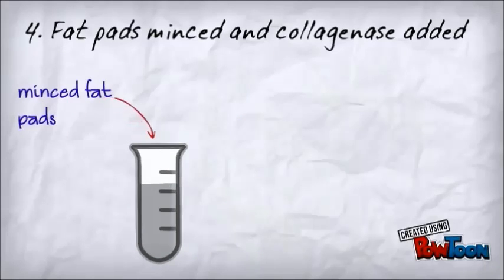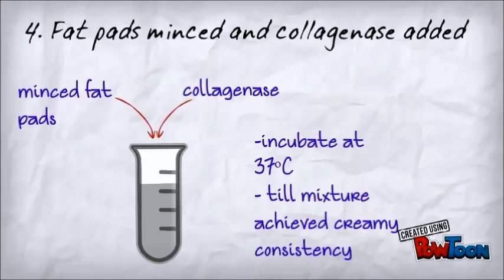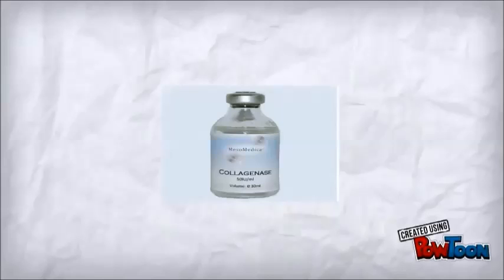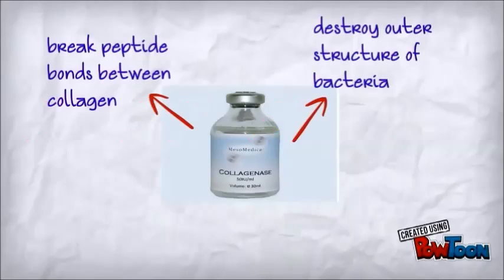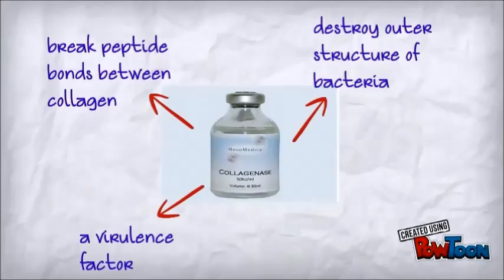The fat pads are minced into pieces and collagenase solution is added. It is then incubated in a shaking water bath at 37 degrees Celsius for 1 hour until the mixture of cells achieves a creamy consistency. Collagenase solution here refers to an enzyme that breaks the peptide bonds in collagen. It will assist in destroying the extracellular structure.